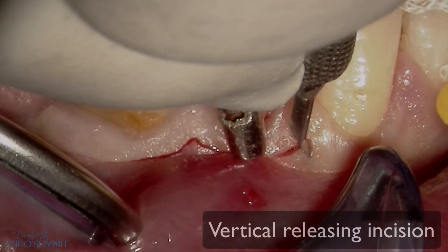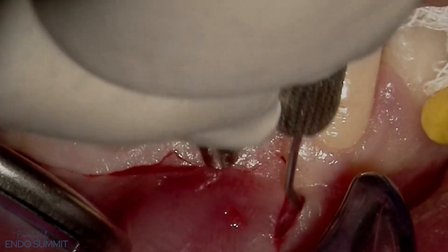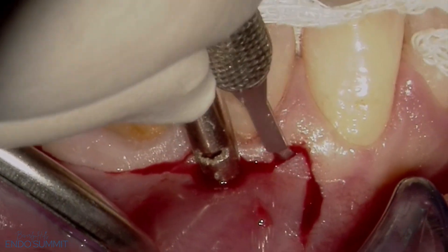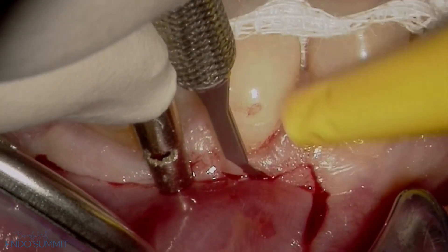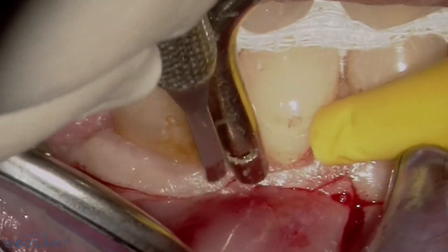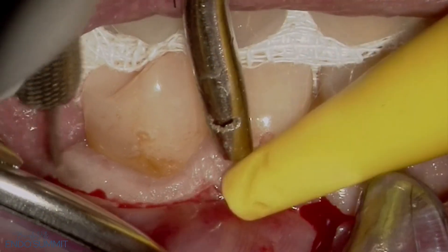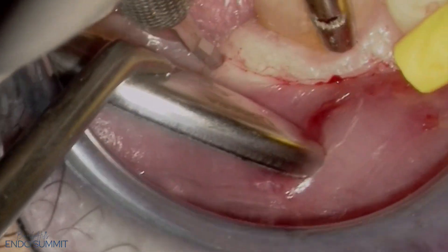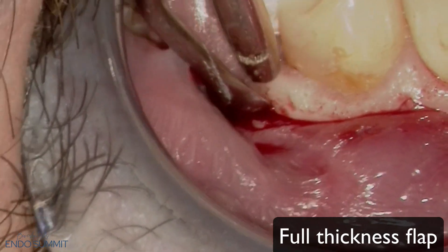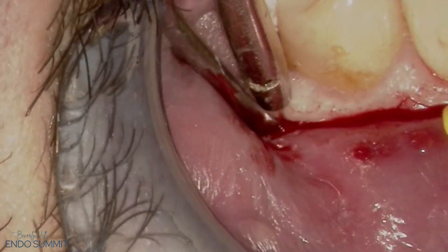A mesial vertical releasing incision is then made. The incision is then repeated in a mesial to distal direction — basically following our footsteps — to confirm that the incision is definitive to the bone level, which will also facilitate the flap reflection. Dr. Castellucci is also adding a small vertical releasing incision, and after that he's reflecting the flap in full thickness. Pay attention to the very gentle, careful, and precise flap reflection.